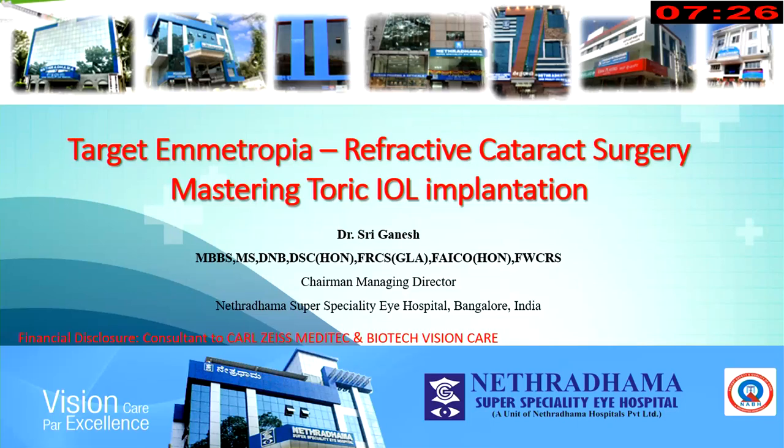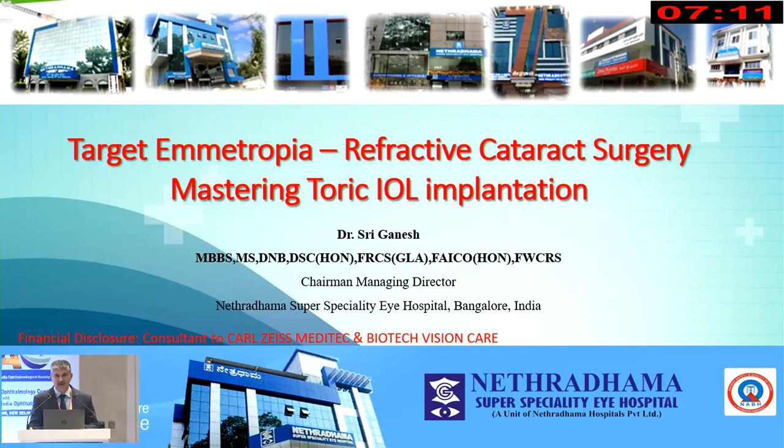Now, if you're looking at refractive cataract surgery, either for monofocals or multifocals, it's more critical for the premium IOLs like multifocals and EDOFs that you correct the astigmatism. Clinically significant astigmatism is astigmatism more than 3/4 of a diopter. So you need to aim for getting the post-op astigmatism within half a diopter.